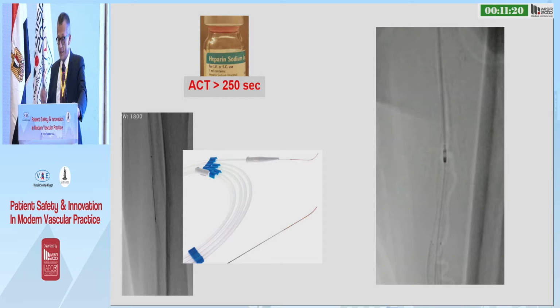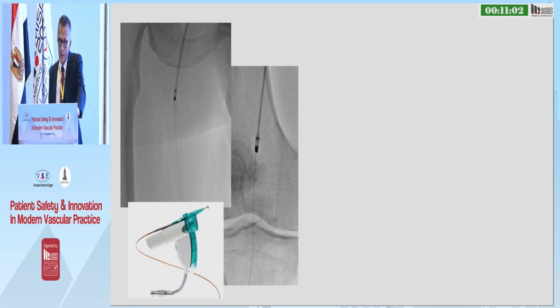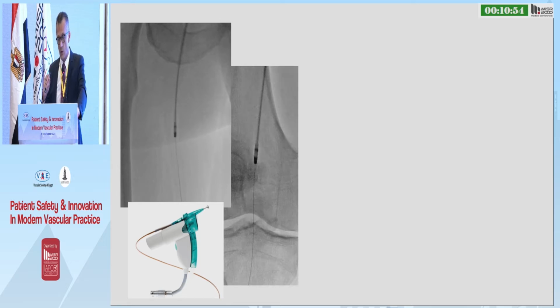Now, after placing the specific guide wire, we are ready to start with the procedure. We place the tip of the catheter into an open vessel, a few millimeters above the occlusion, and we start with rotation at this point, in order to activate the aspiration. And then we go through the occlusion with this typical movement, slowly, not more than 1 centimeter per second, in order to obtain the maximum removal of all fragmentable material with this typical fore and back movement.